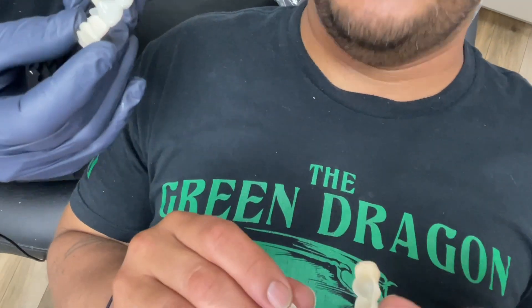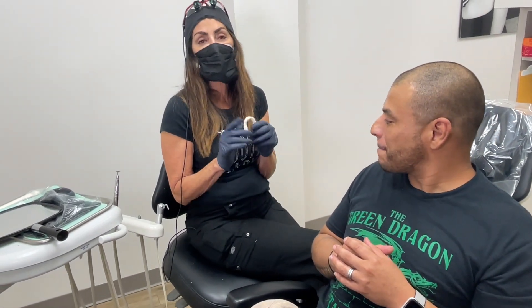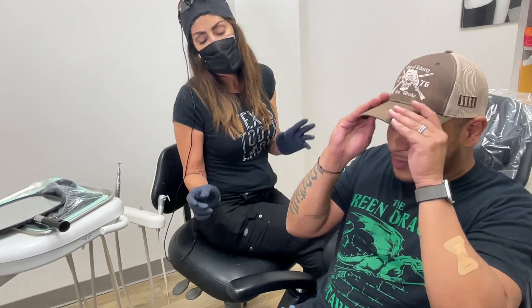It's a more durable material. I love these — these really look a lot better. So now we're going to do the taste test. The final test is everybody goes, can you eat with them? People ask me, well, you always give them soft stuff to eat. That's because we don't have a lot of hard stuff in this office, but we got chips today thanks to my assistant.